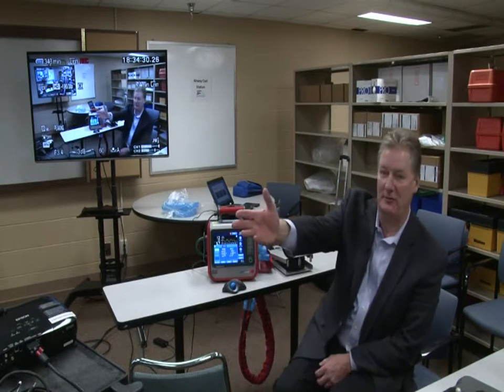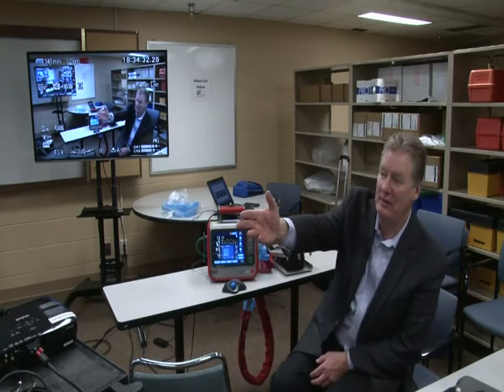And I would guess, the smallest person in the room is you, and if we hooked you up to the ventilator and I said, just give a normal sigh, I bet you that would be 1,500 cc's easy. Our normal inspiratory capacity is 3,500 or 4,000 milliliters. I would defy any of you to give yourself a pneumothorax right now without taking a deep breath and throwing yourself on the back of the chair. It's just not going to happen.